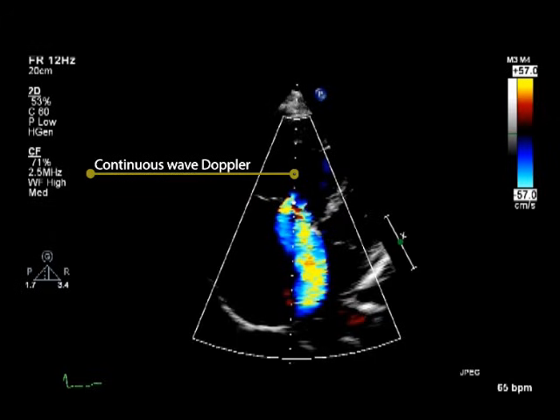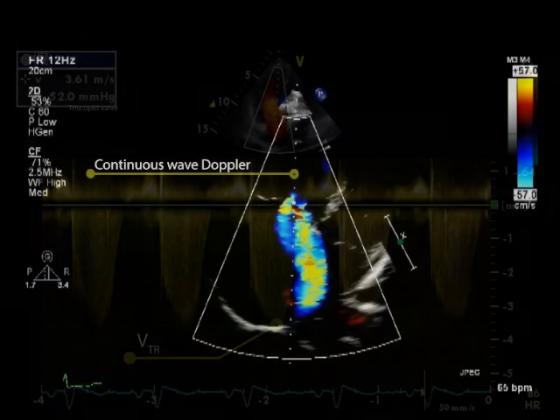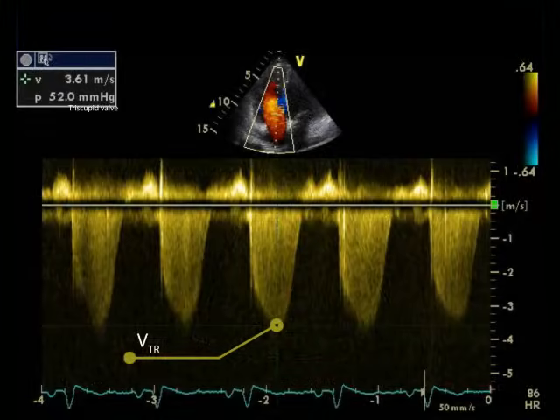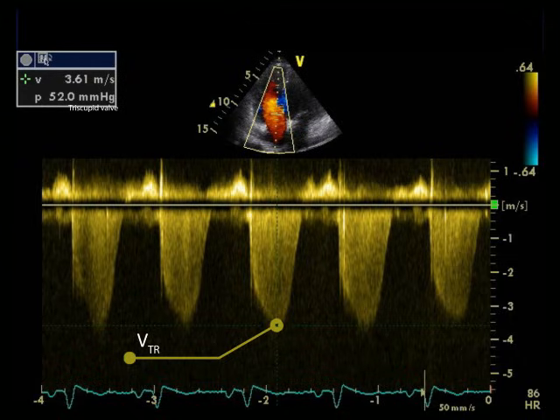The tricuspid regurgitant peak velocity is best measured in the apical four-chamber view. This is because the direction of the jet and the Doppler beam are parallel to each other in this view, so estimation of the jet velocity will be more accurate. Continuous wave Doppler measures peak tricuspid regurgitant velocity in metres per second.